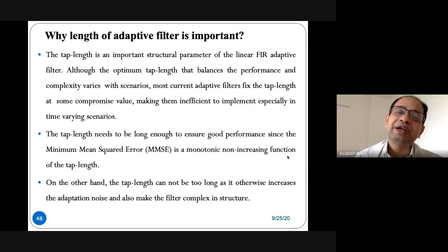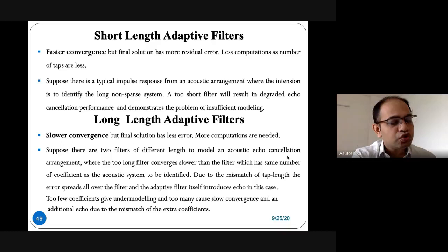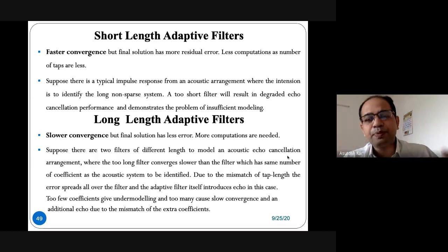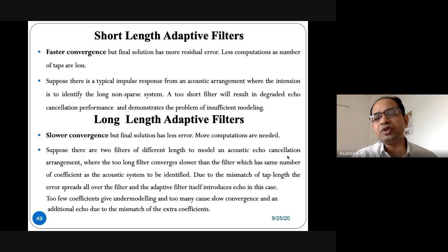Parallelly I do a number of work. So I work on feedback along with echo, machine learning, and some other techniques. In echo, this tap length thing was quite successful because there we go for thousands of taps and optimizing the filter order or the total number of taps by proposing cyclic optimization, applied ML techniques, LMS based techniques. We optimize the filter taps. That means how many weights or coefficients are enough for the process. The same technique we used for the feedback cancelling.